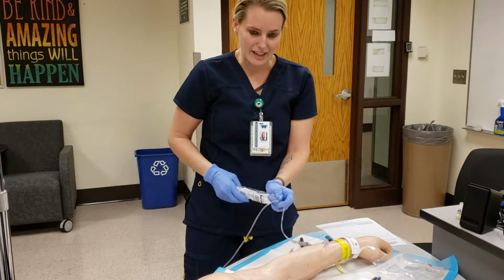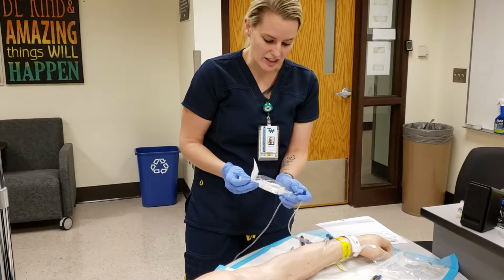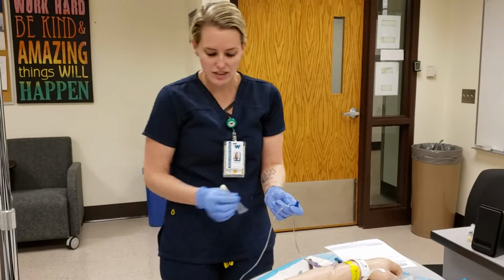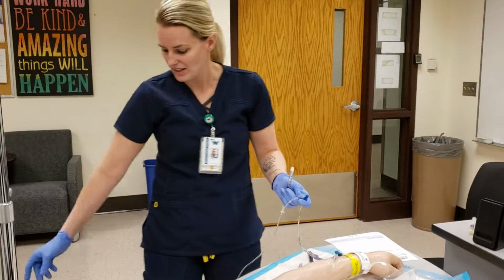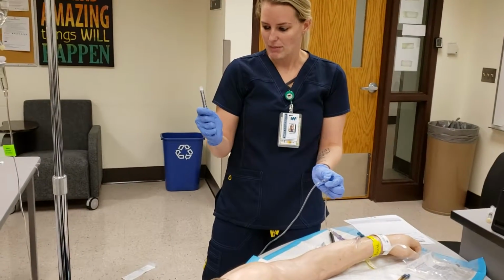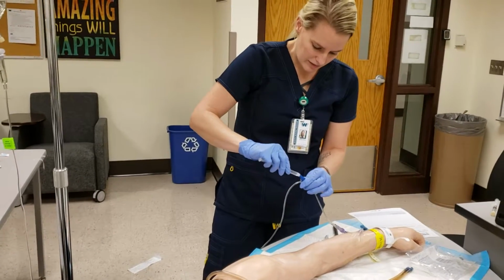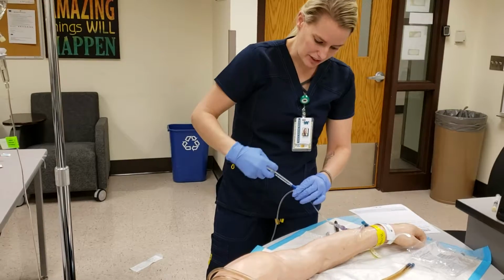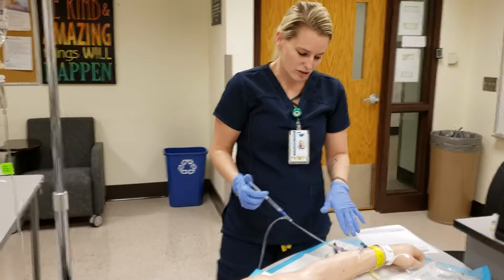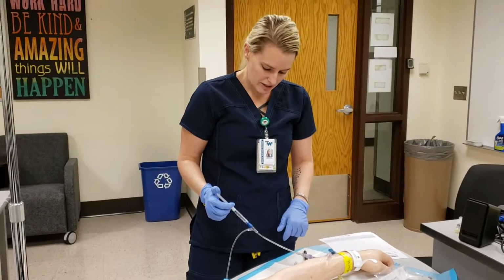And while I flush, I need to make sure that I am not flushing quickly. So I'm gonna flush at the same rate that I was pushing the morphine, so that the client doesn't get an overabundance of the medication at one time from this remaining IV line. How you doing, Shirley? Pretty good? Okay. So I would also push this slowly to make sure that the client is not getting too much.